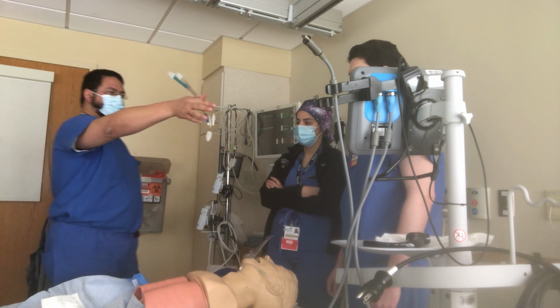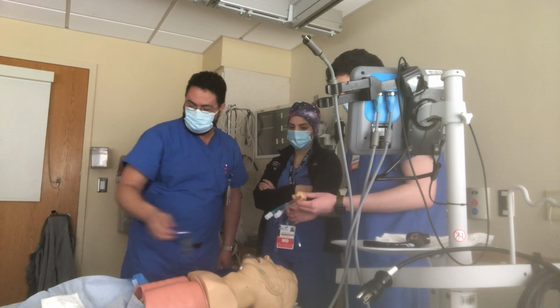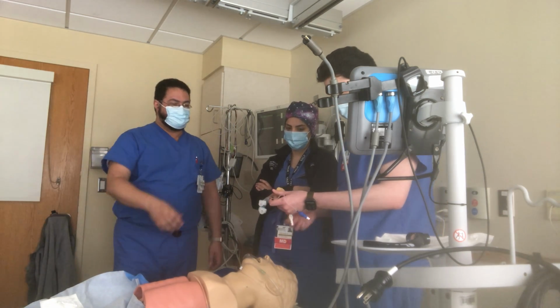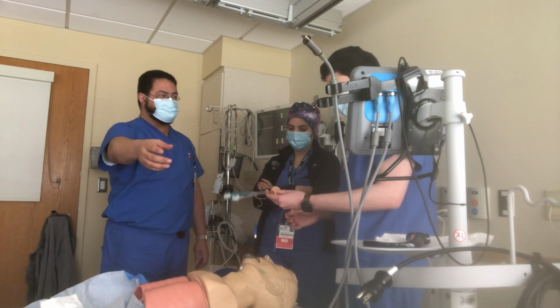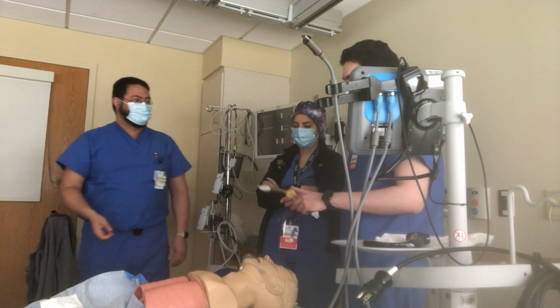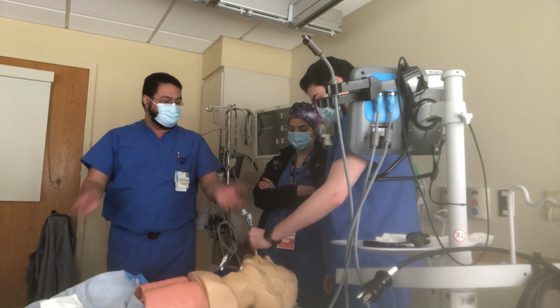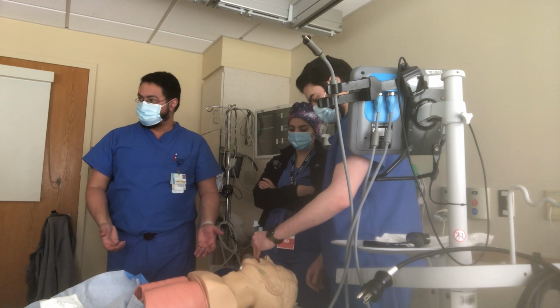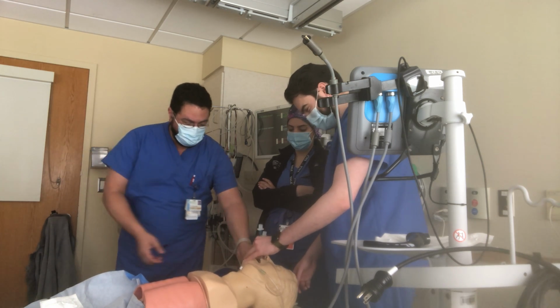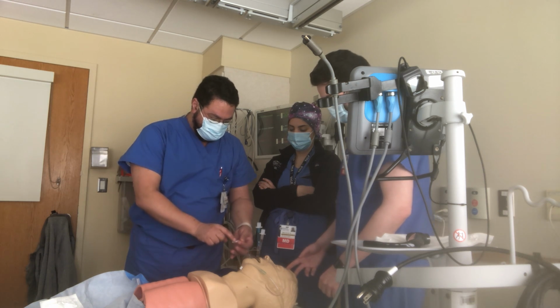This is foolproof. Anesthesiologists hate this because it takes our job away. Literally, it's made for paramedics to put it in somebody who's upside down in a car wreck or something, and intubate. So this just goes in anywhere. It doesn't matter where it goes. Most of the time, it goes in the esophagus, and that's it. You're done. You intubated the patient, and then here you put 12 cc's.